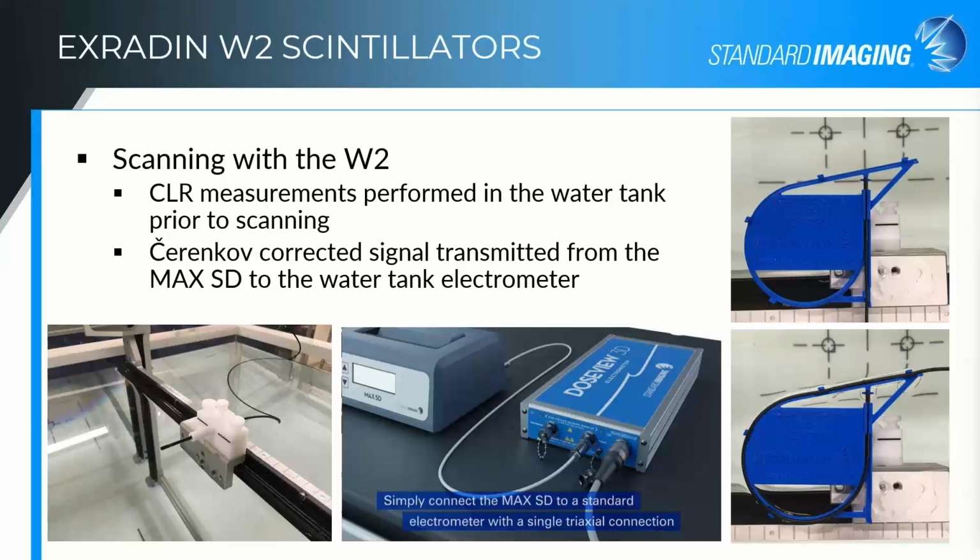Longevity of the scintillating fiber and signs for need of replacement of the scintillation fiber. Generally, I have people watch the overall signal level as well as the CLR, and once that decreases below about 80% of what it was originally, I would recommend looking at updating your fiber. So ideally, that would last you 3 to 5 years or so. But I've also had people step on the fiber. I've had them get kinked and broken because a grad student wasn't careful with it. So there's a reason that we make replacement fibers. It's actually quite easy to get one of those to you.